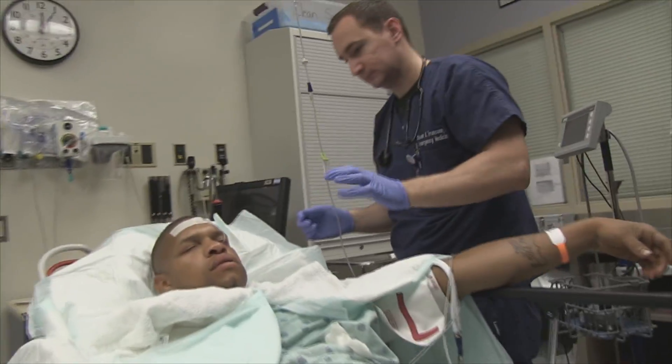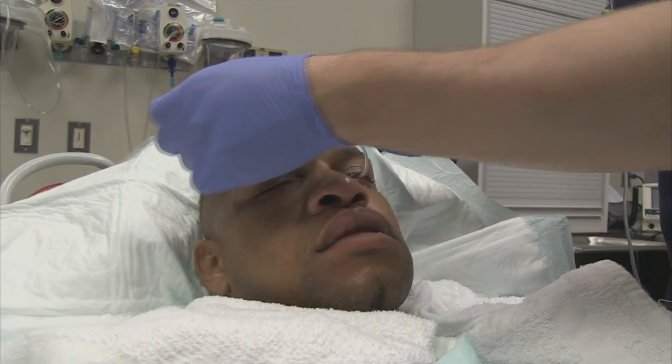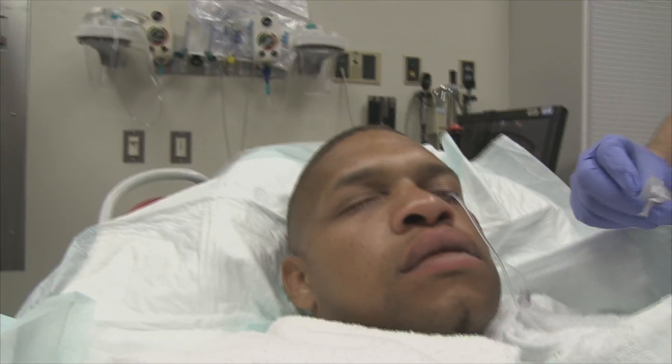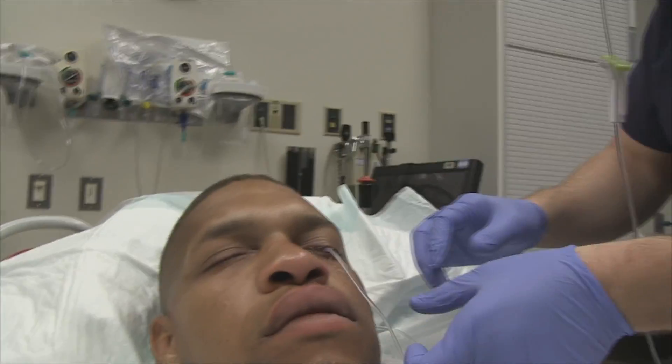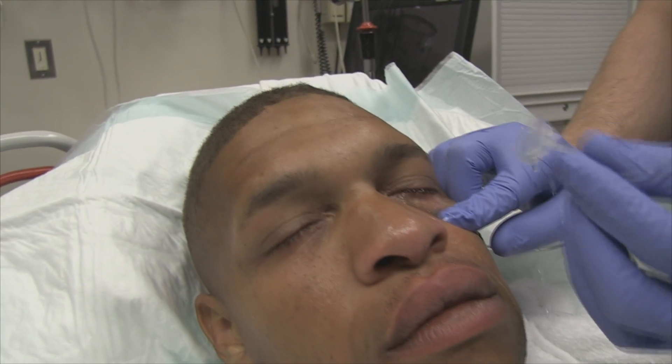One lens is out — the camera's rolling again. What are you doing Steve? Just reverse order to remove it, then turn off the flow.